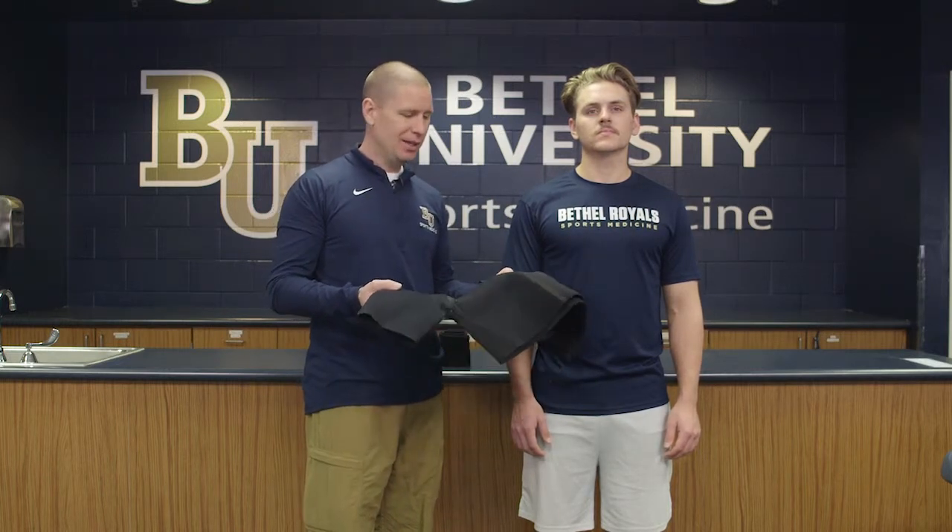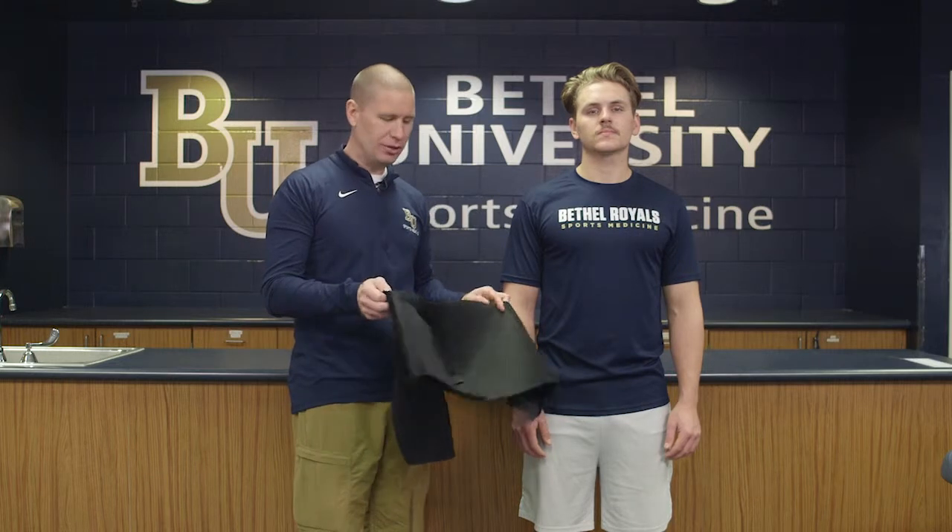It's very comfortable. The athlete can put it on themselves and use it every single day, so it becomes one of the primary shoulder braces that we actually use.